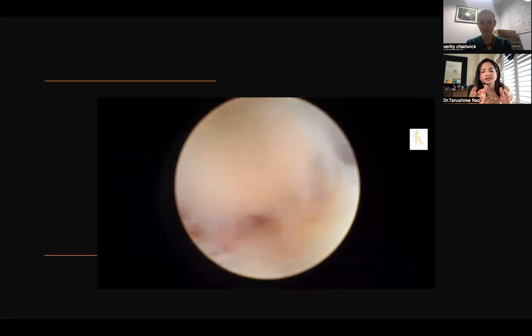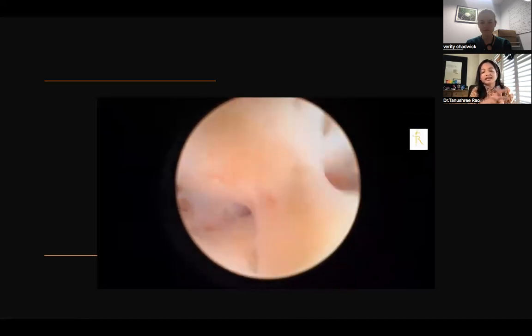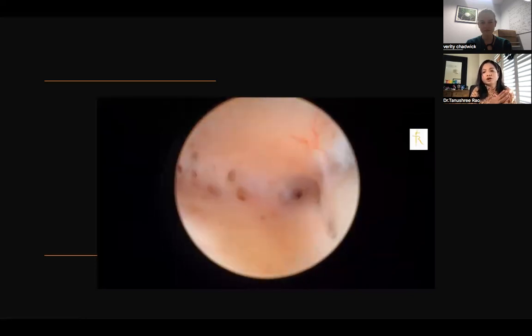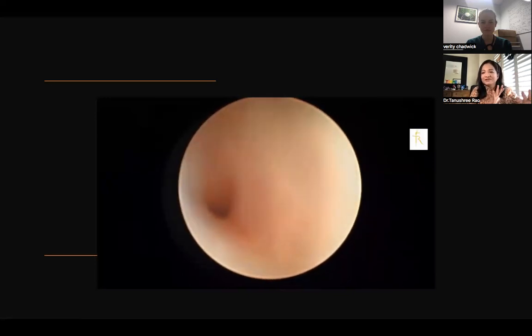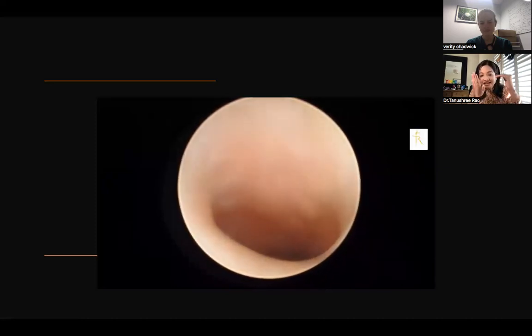Okay, so this is part of the cervix. This was a case of a postmenopausal woman who had bleeding, and we had to rule out thickened endometrium and a precancerous or a cancerous lesion. As you can see, the cervix is quite stenotic. This is sometimes a common finding in postmenopause. There are various ways to tackle this, and I'll save the nuances of hysteroscopy, including fluid management and all the others, for another day, which I haven't included today. So as you can see, just persistence.